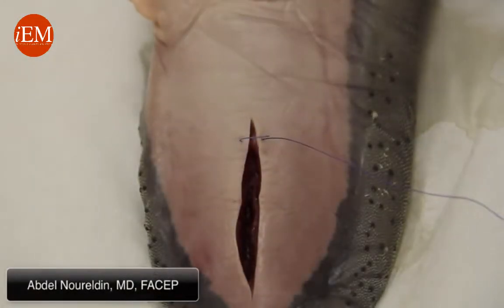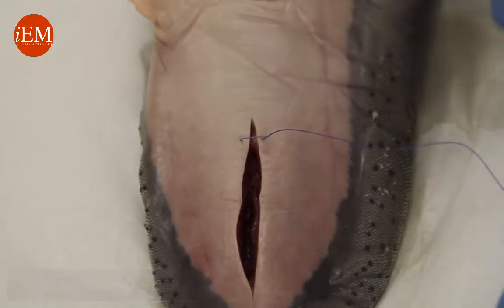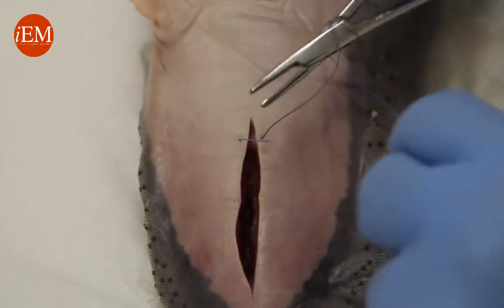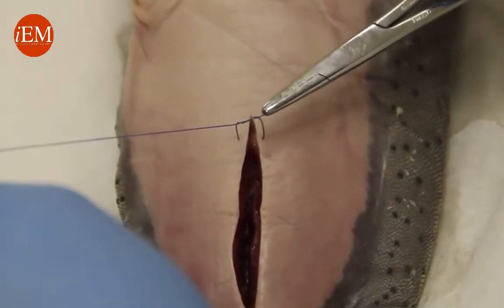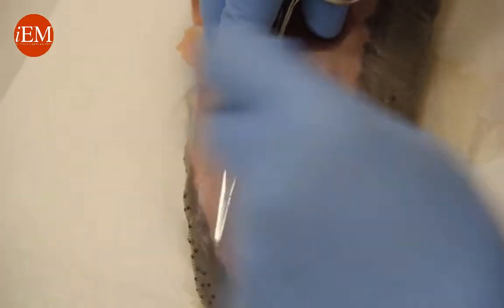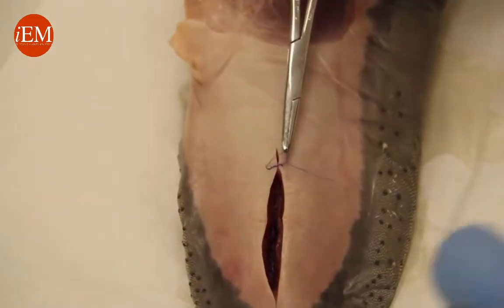Now we're going to do a square knot using an instrument tie. Take your driver or your needle holder, put it between the two threads, wrap it the first time twice, grab the tip, then pull and make sure it comes down flat. Again, put it in between, wrap it once, grab it, and again you need to come down flat.